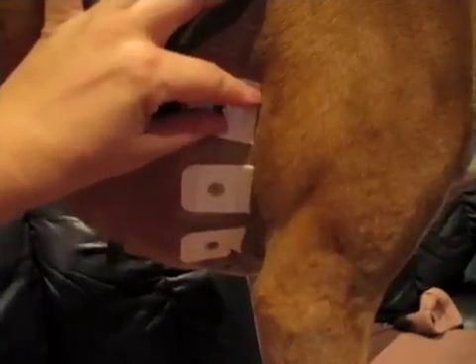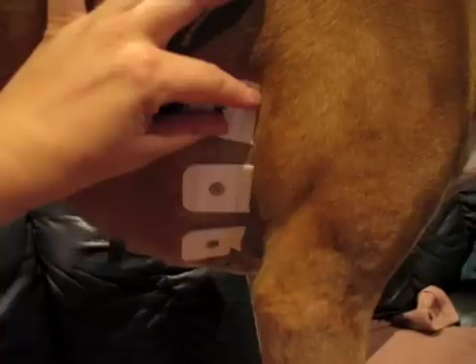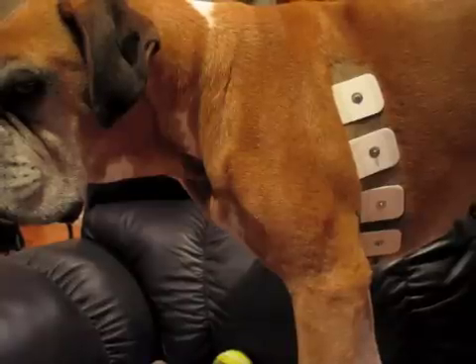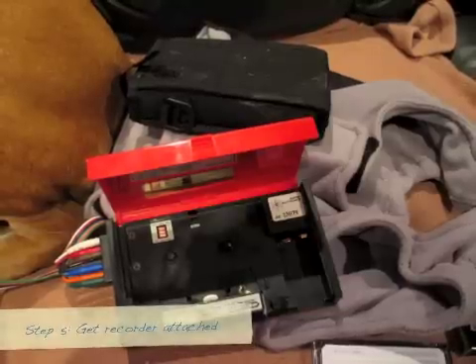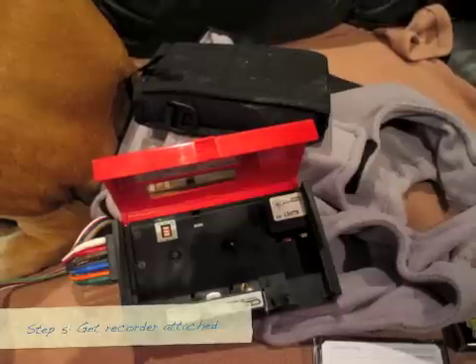Now this is me attaching the electrodes to the dog. You need to press quite firmly without obviously hurting the dog. I'm just pressing the electrodes in here to make sure they're stuck firmly. Here's the side that needs the 4 electrodes for my particular monitor. That side's now completed. Both sides are completed and now I'm starting to get organised with the recording.